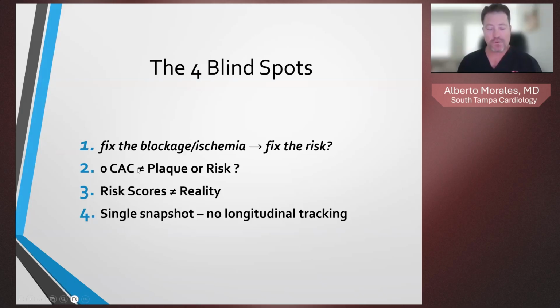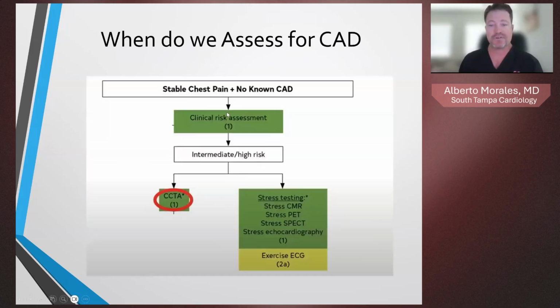I'm going to go over calcium scoring and what is the true power of a zero calcium score, and does it mean that patient is at low risk: scores versus reality. And then I'll conclude with a single snapshot, how we approach patients, whether we are following them longitudinally for disease or not.